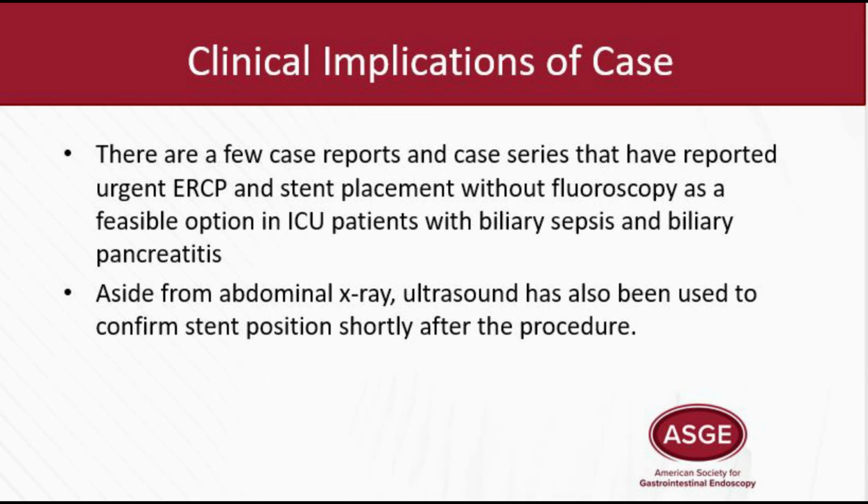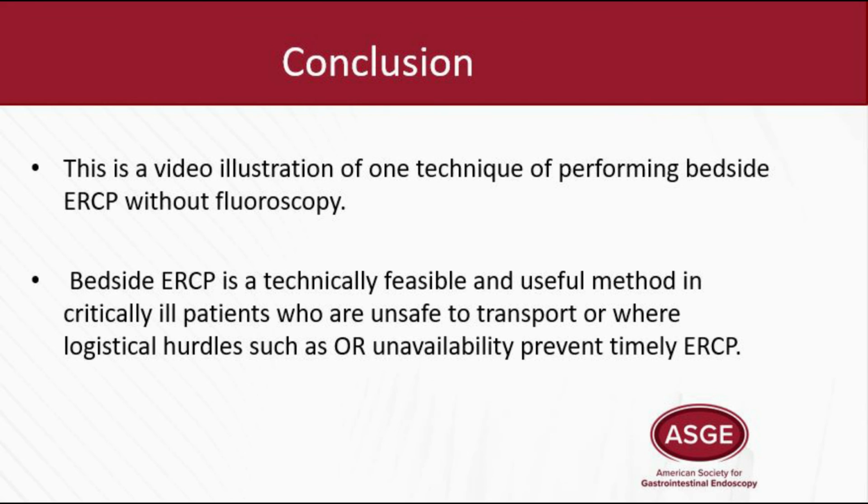There are a few case reports and case series that have reported urgent ERCP with stent placement without fluoroscopy as a feasible option in ICU patients who presented with biliary sepsis and biliary pancreatitis. Aside from abdominal X-ray, ultrasound has also been used to confirm the stent position shortly after the procedure.